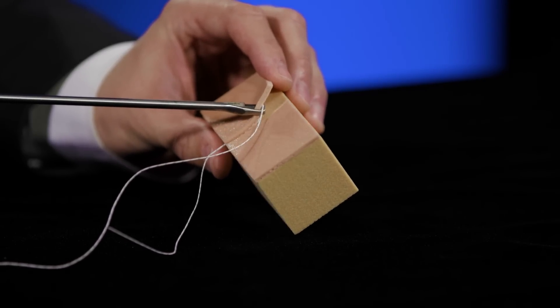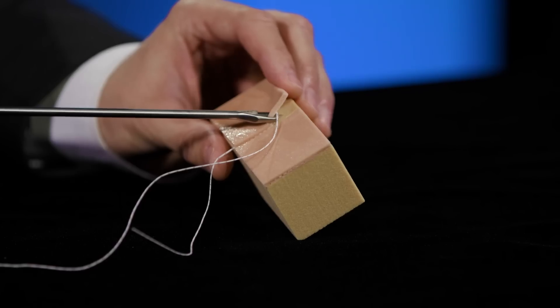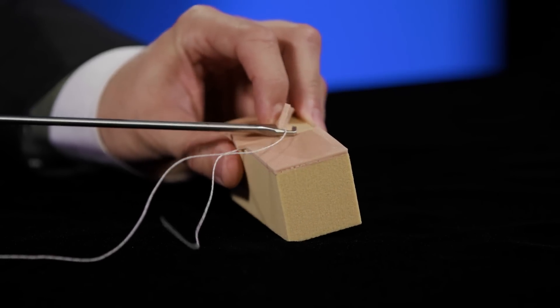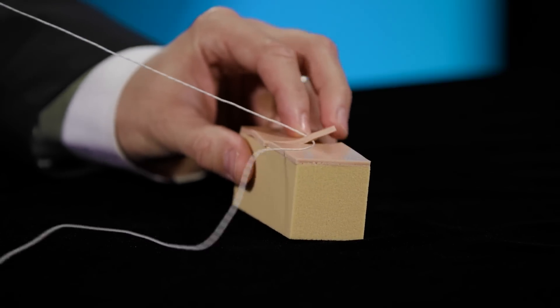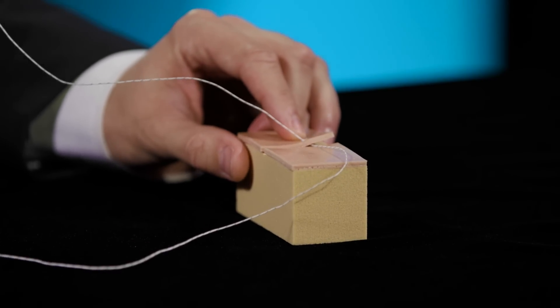You'll simply compress with the front trigger and squeeze to push the needle through the tissue. You'll hear a click to know you're fully engaged. You'll then release your handle, come out, and now you've got your first strand of suture passed through your capsular tissue.